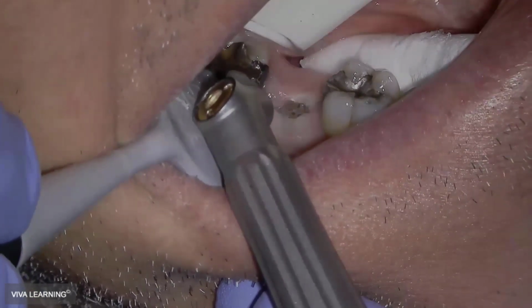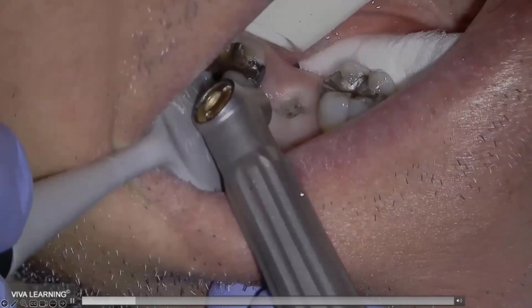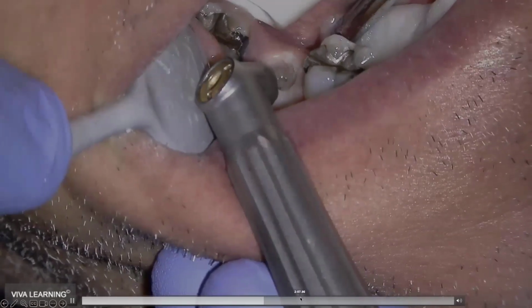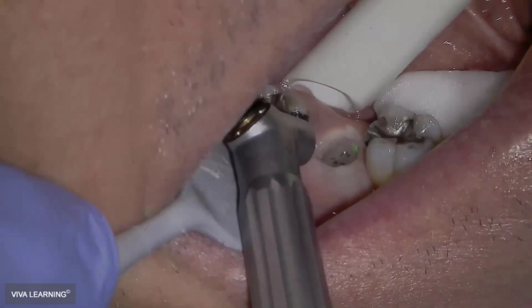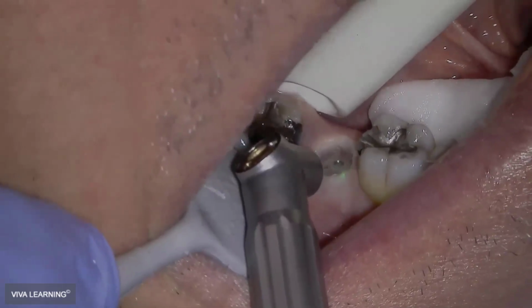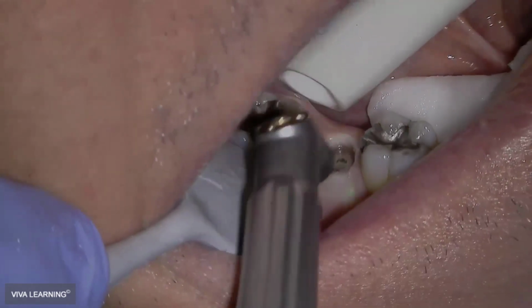We did it as an immediate extraction, took the tooth out, implant goes in, and you're just starting to see the little hex screw hole right in there. Jumping forward for time, you can see where we're starting to expose that out. But the main thing with the laser is now, even if you don't have a buried healing abutment, you have the ability to sculpt that emergence profile so your implant doesn't look like an orange on a toothpick, right? You can actually sculpt that away.